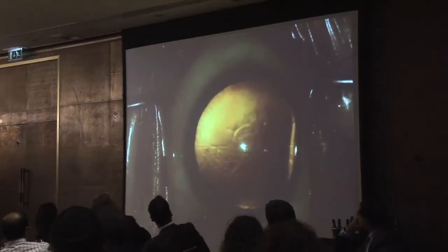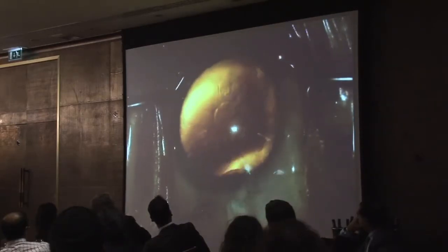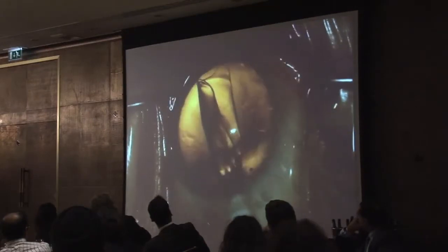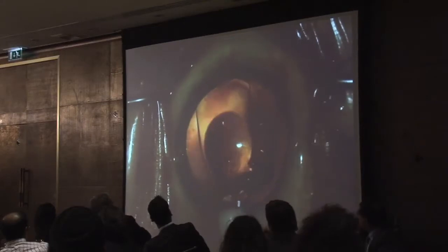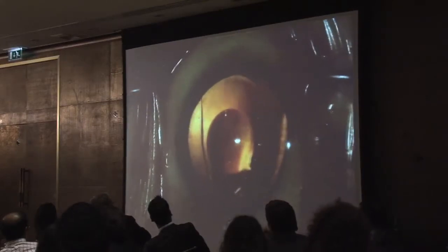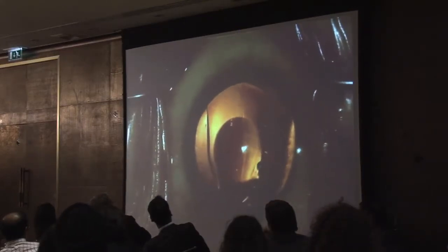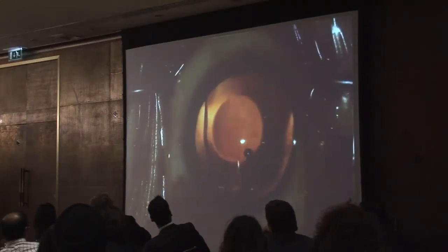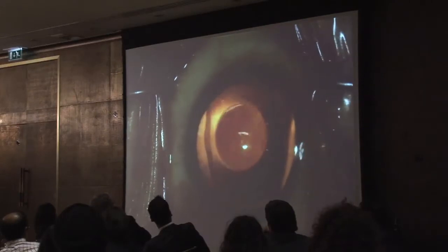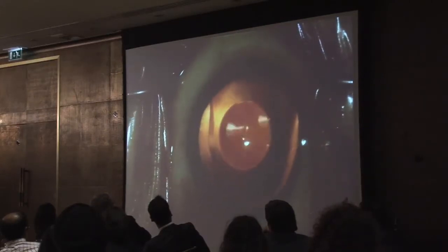The cartridge is then placed firmly against the incision and the ICL is injected. Wait to remove the cartridge until the distal part of the ICL is unfolded. To push the lens downwards, a little bit of methylcellulose is placed on top of the intraocular lens.